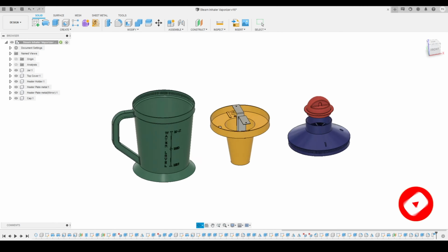Now we'll go to the Modify panel again. We'll activate the shell tool and select this top face, and I'm going to give it a thickness of 1 millimeter. Here you can see the body has been converted to a 1 millimeter thick shape, and it is hollow from inside. We'll activate the same tool and do the same for the bottom piece.